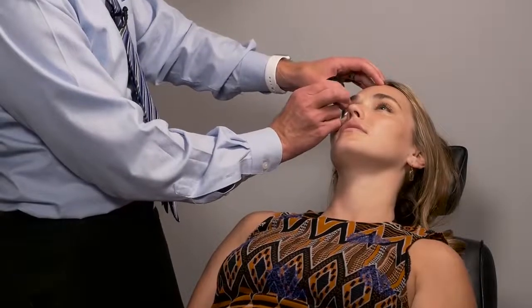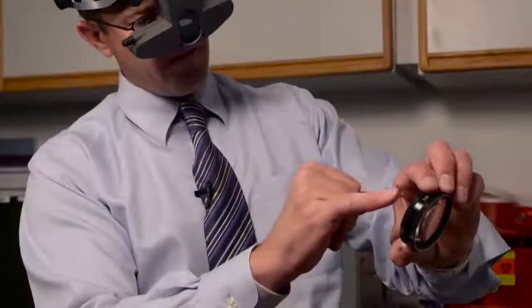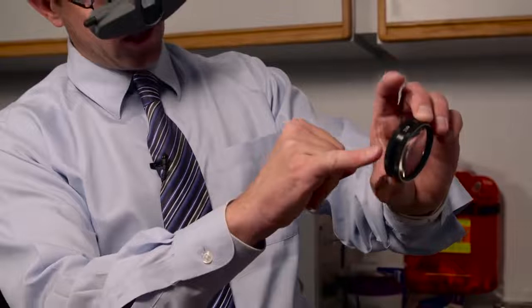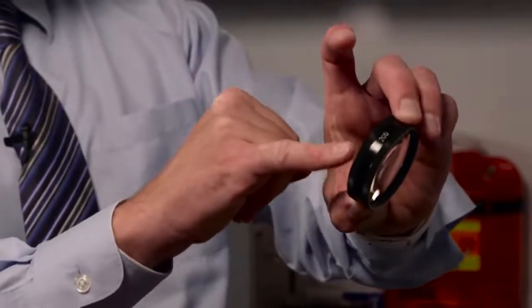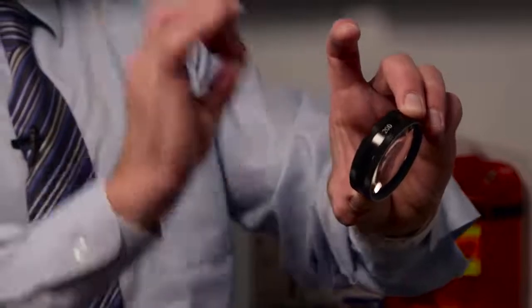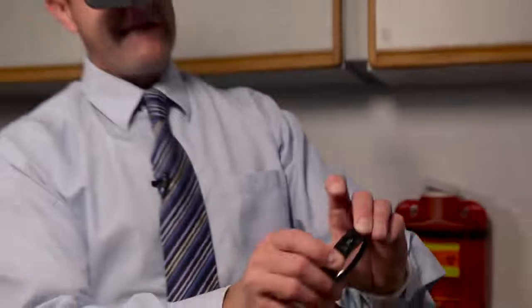Once you have the 20 or the 28 diopter lens in the position where the view fills up the whole inside of the lens, so you'll see the whole retina inside of the lens, not part of it, but filling up the whole lens, that's the right location. And then you learn to look at all parts of the retina with the view itself being filled with the retinal exam.